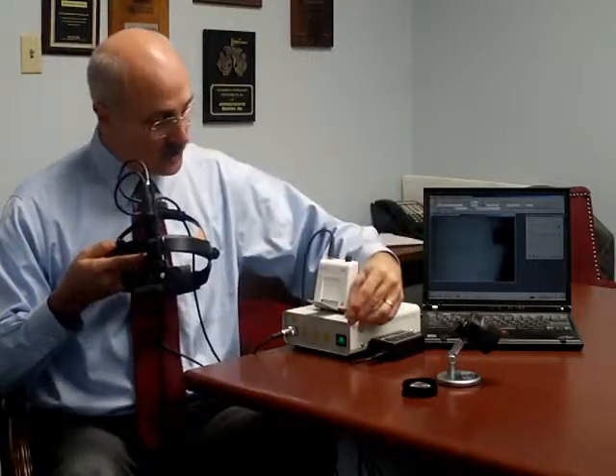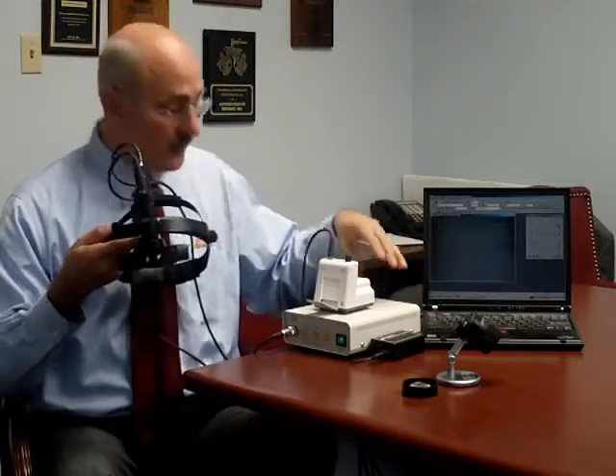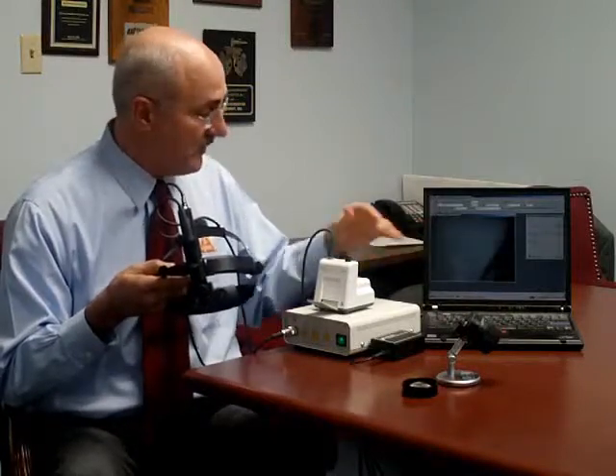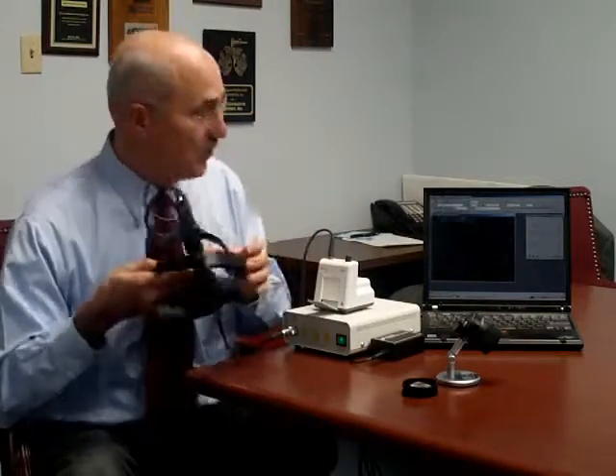The other components are the EN50, which is a standard power supply for the illumination system of the indirect, and a camera control unit, which is a low-light camera providing much better image quality even at lower light settings. It has both composite and S-video output, and we now incorporate an external digitizer that will allow you to interface with any computer, giving you the ability to digitize both still and full motion video.